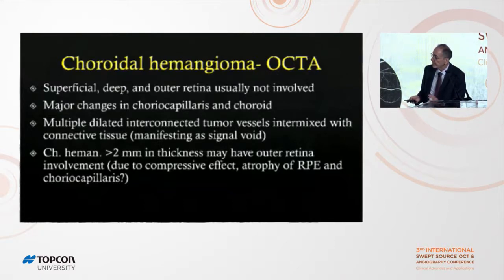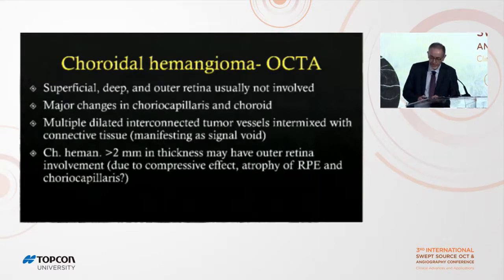This may be due to a compressive effect, atrophy of the retinal pigment epithelium, and maybe some choriocapillaris, which makes the tumor vessels visible in the outer retina as well.